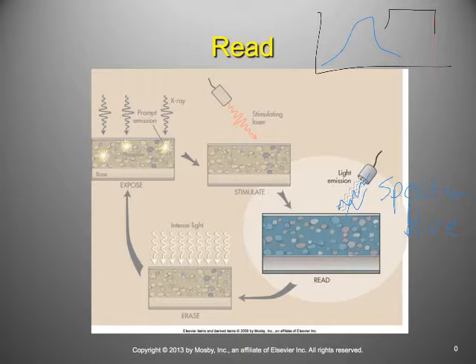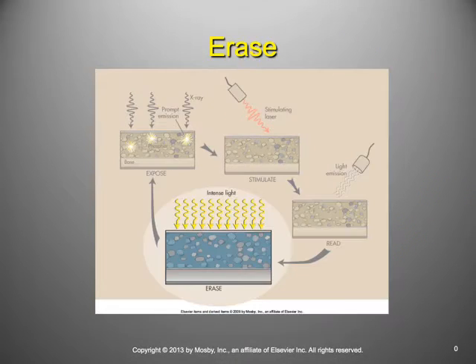So again, the X-rays cause this metastability inside the photostimulable phosphor. We scan that with a laser. It emits light. That light is picked up by a photomultiplier and digitized. Okay? The final step of CR, and it's the part that you are able to see if you're standing there by the CR reader, is this erasure phase.